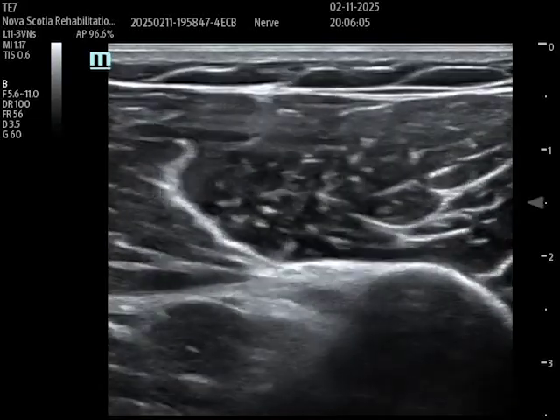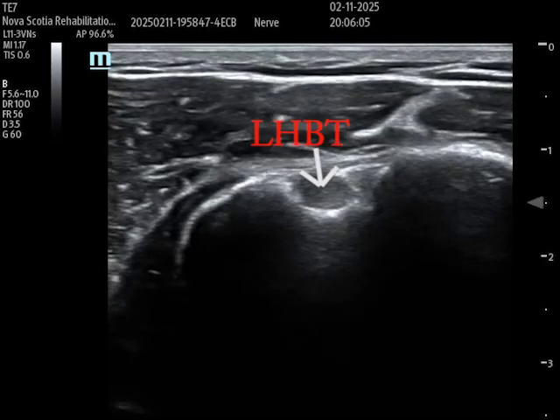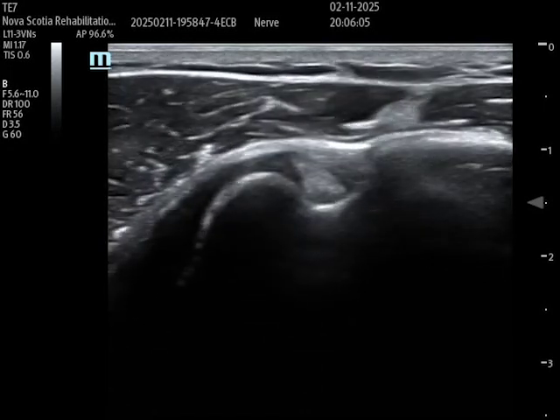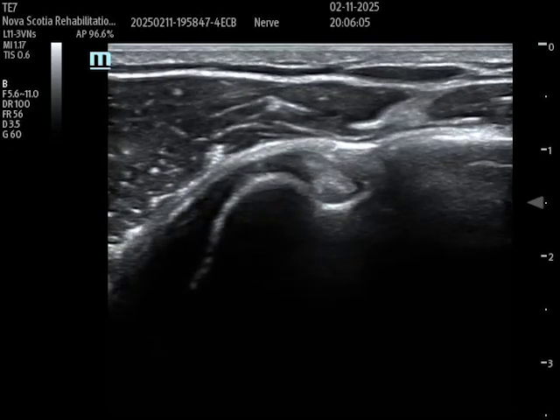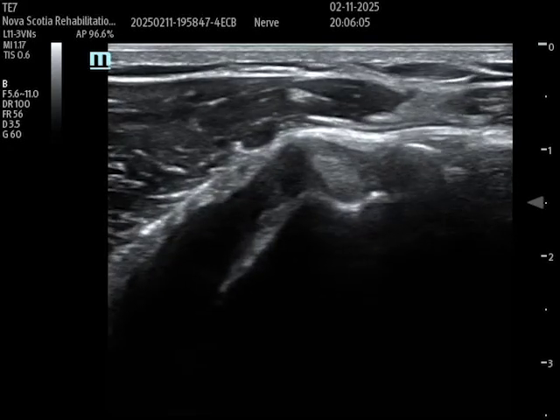Here I'm scanning the biceps tendon very distally, and as I move proximally in the transverse plane, there's the long head of the biceps tendon. This is really the most important structure to identify. When looking to find the rotator interval, I will start distally and now I'm starting to move that probe a little bit more proximally. You can see the bicipital groove is going to start to disappear as I move slowly proximally.